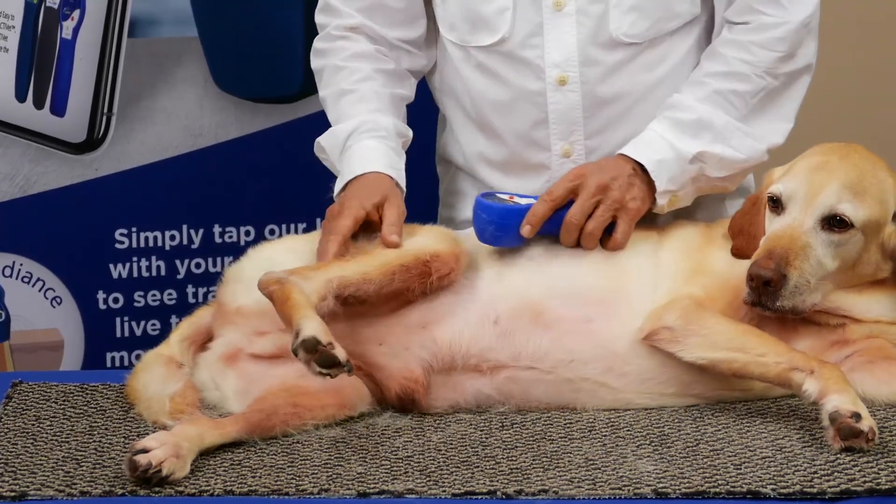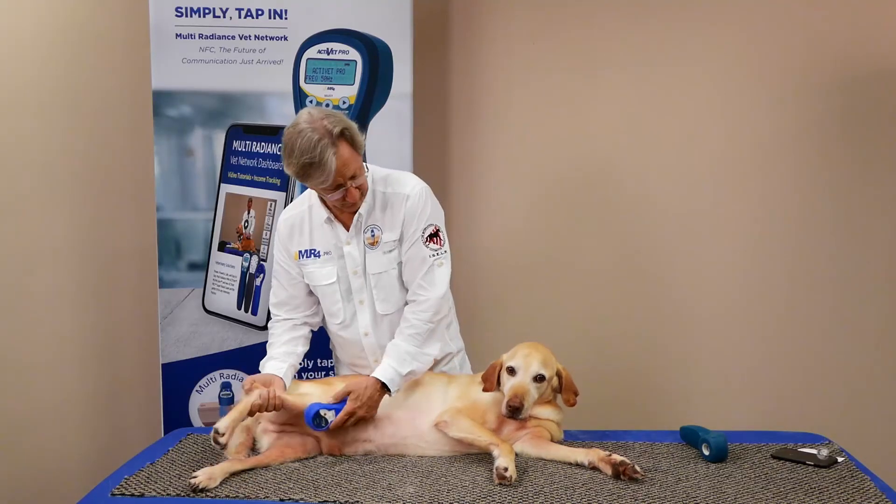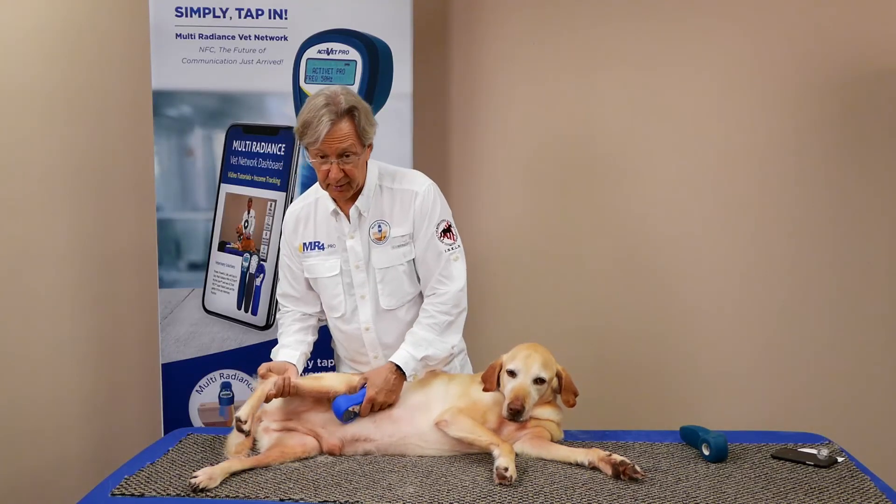So compliant, so easy, so convenient for your customers, and so easy for the animal to accept their laser therapy treatment.